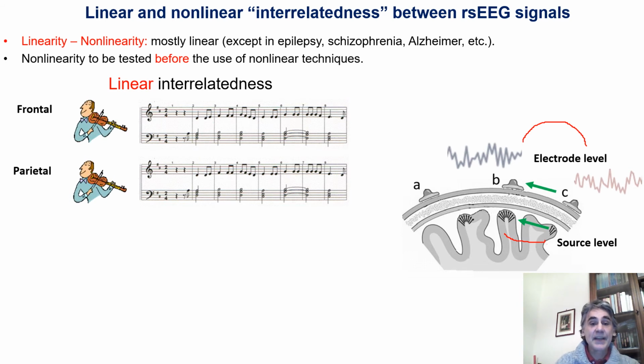The linear assumption of interdependence of EEG activity at electrode pairs is based on the relation between the phases of cortical sources of EEG activity. In the picture, you see, for example, the case of two musicians in phase in their activity to produce a musical performance.